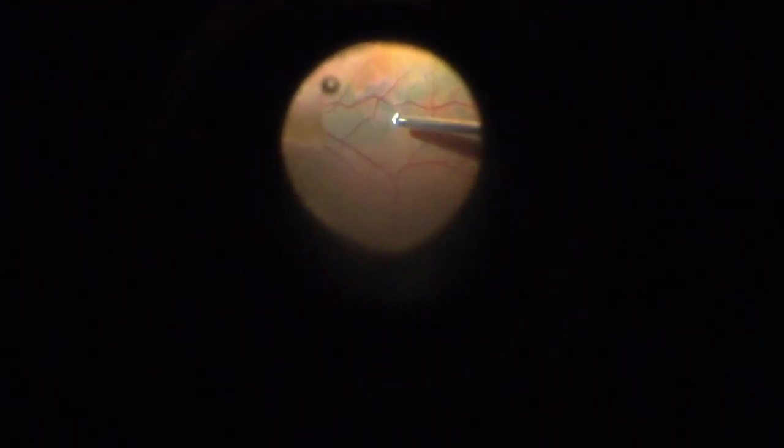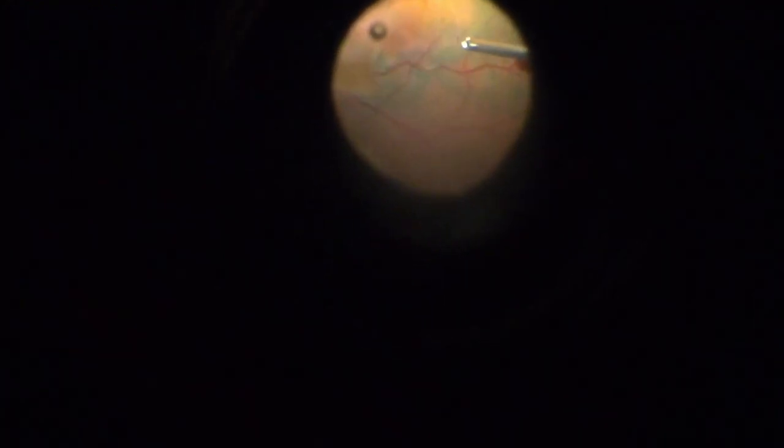So we're just playing with the pressure a little bit. We went from 35 to 60. Back to 35, back up to 60. But all that's going very well. So what we're going to look at doing now is peeling down here, making sure we're not leaving any epiretinal tissue. I don't think we are actually. And we'll peel this piece down. And then we'll take a look just a little bit outside the arcades, being in a PVR case, make sure we got everything.